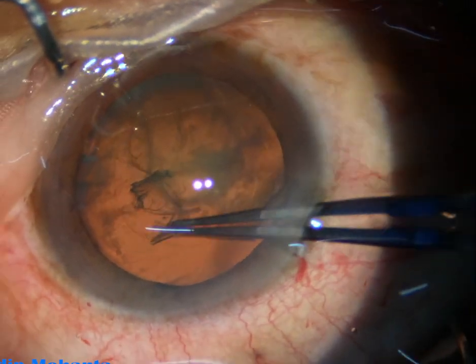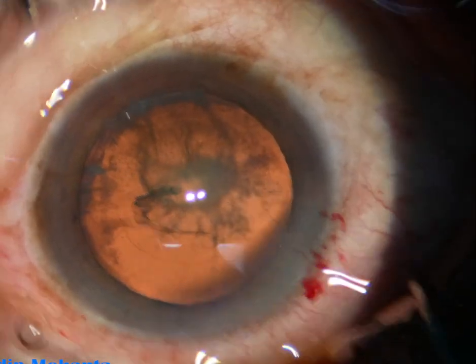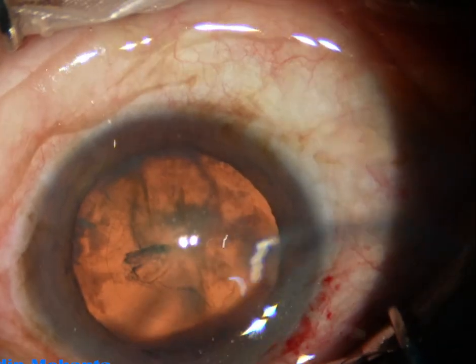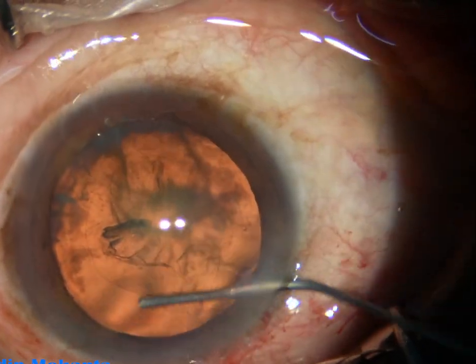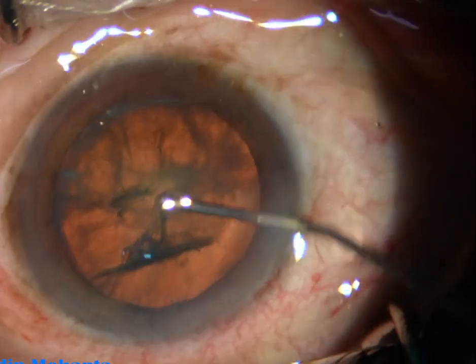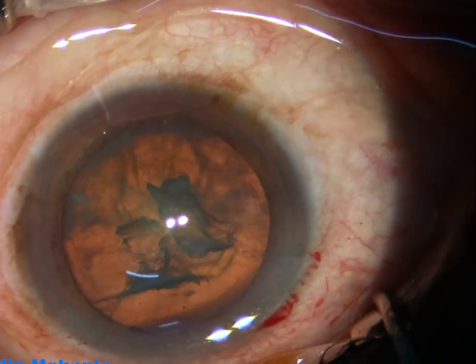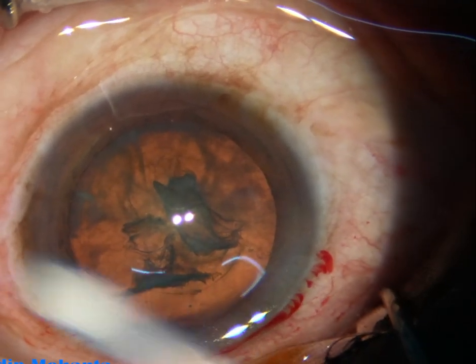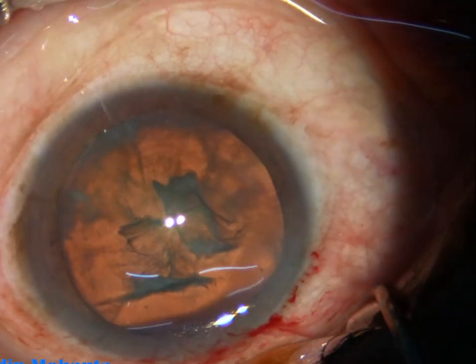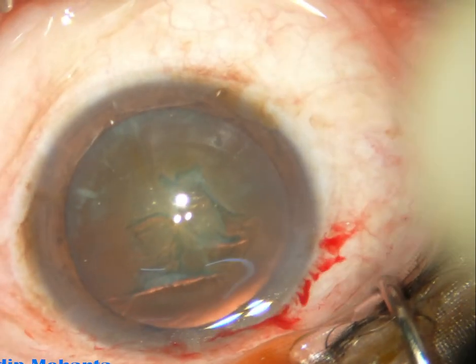Now I go to coaxial illumination and perform capsulorhexis with the help of utrata forceps. The size of this rhexis is about 5 millimeters. Hydrodissection is done with a 27 gauge cannula and balanced salt solution. The fluid wave goes to the opposite equator and the nucleus is tapped. In this case, I did not rotate the nucleus.